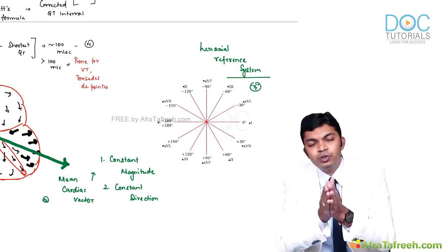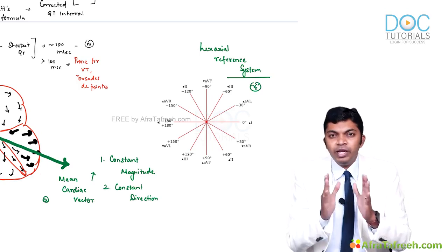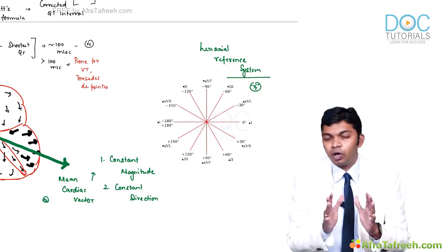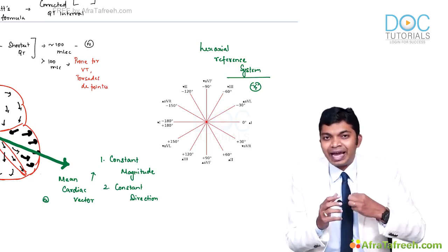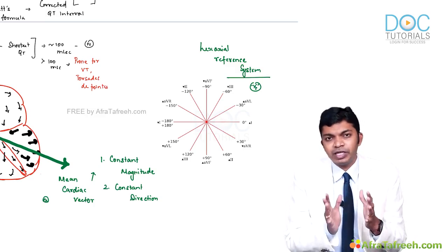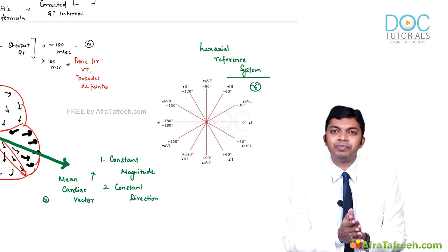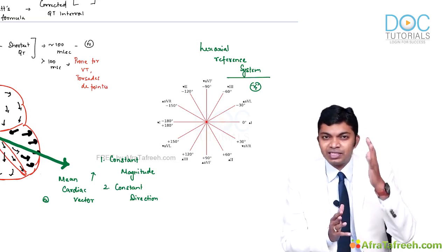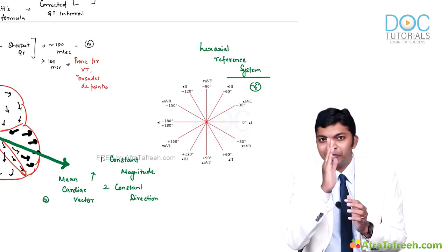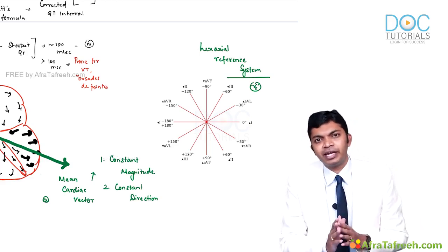Before that, doctors, I want you to pay close attention to this one point. Always remember, when we speak about the axis of the heart, we are not referring to the anatomical position of the heart relative to the midline of the body. Many students have made this mistake. When the word axis falls into their brain, they imagine the anatomical position of the heart with respect to the midline of the body.